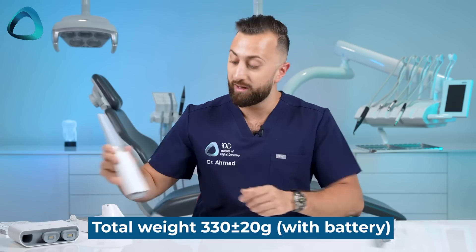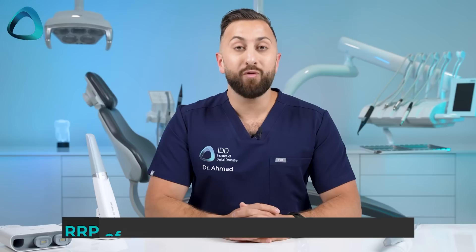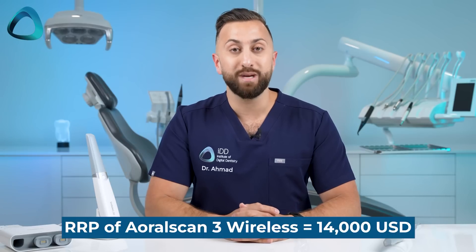Speaking of wireless, of course there are many benefits, mainly related to ergonomics, and they're generally more enjoyable to use. What are the downsides? Because of all the wireless technology built in, this scanner weighs 100 grams more than the previous generation wired scanner. It is also $3,000 more expensive at a recommended retail price of $14,000 USD. This does make it one of the lowest cost wireless intraoral scanners on the market, but you are paying $3,000 more for this luxury compared to the wired version.